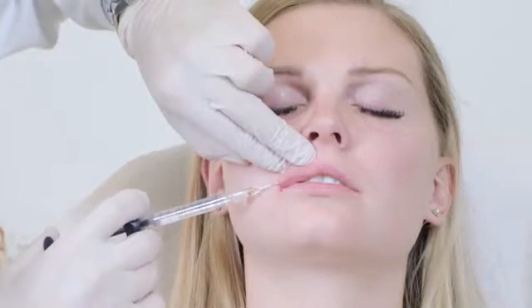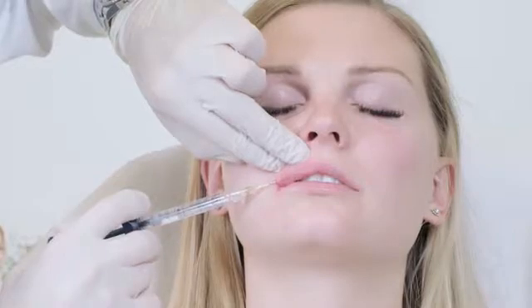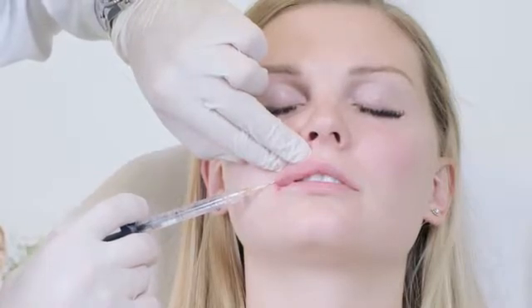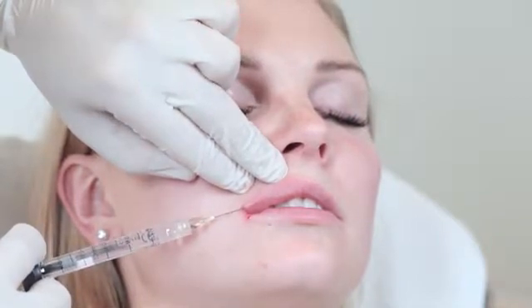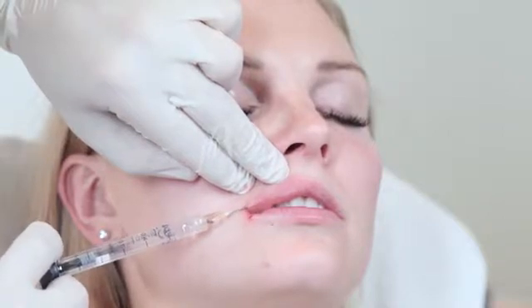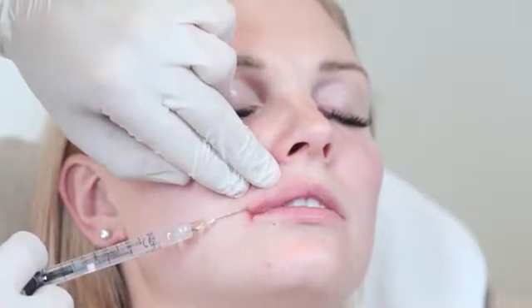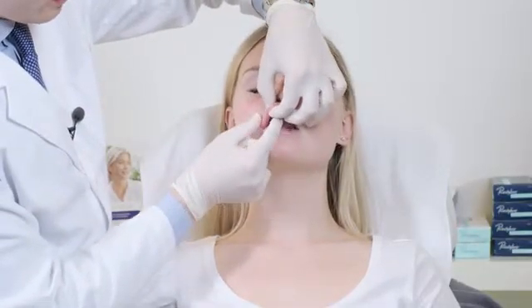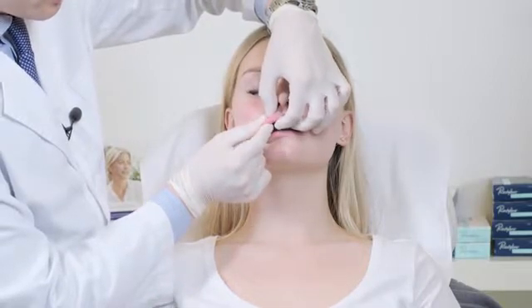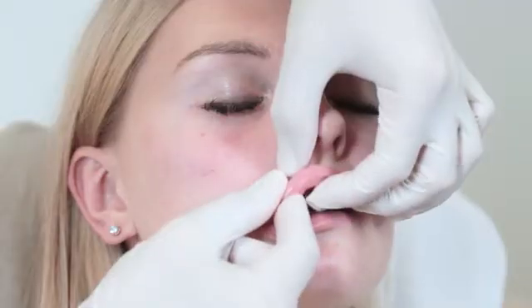Once the cannula is in position, I inject a small quantity of product with low extrusion force as I retract. I watch the lip as the product slowly fills it, and that way I can easily control the amount of product needed to create a natural looking lip. So far I've used about 0.3 cc for the upper lip. Once a sufficient amount of product is injected, I prefer to invert the lip, mold and massage the product, making sure that there are no lumps, especially on the wet-dry border.